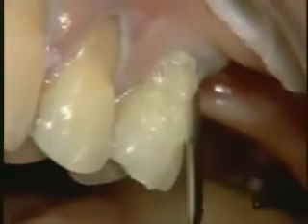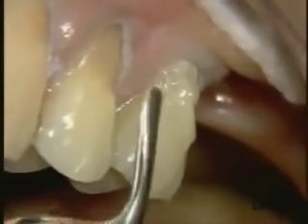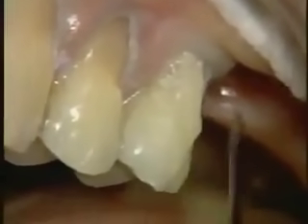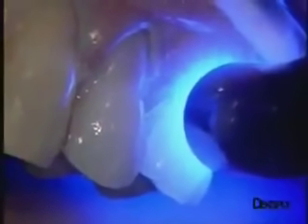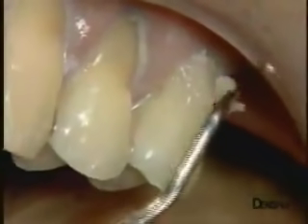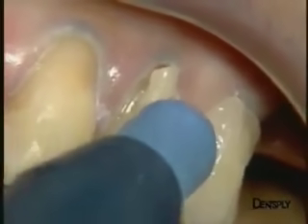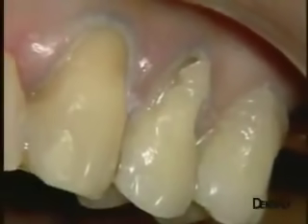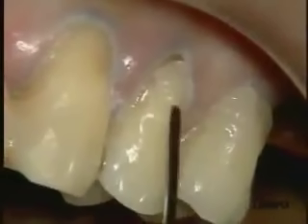You can note how easy it is to apply the material, and that it does not stick to the instrument. We are working here without any matrix system. In certain situations, this would be particularly beneficial when having to place several layers with several shades on one tooth. We proceed in the same way on tooth 24, placing material with pressure, and because of the thin nature of the marginal gingiva, we take care to avoid any excess here, to avoid creating retention zones that would be irritating to the soft tissue.